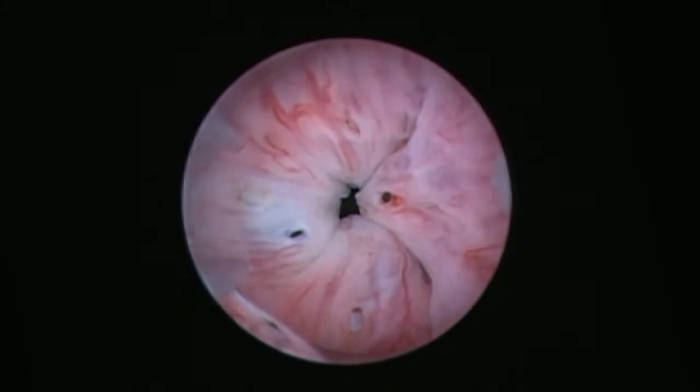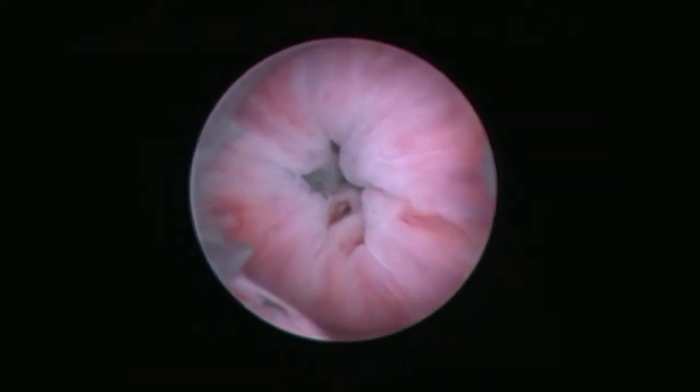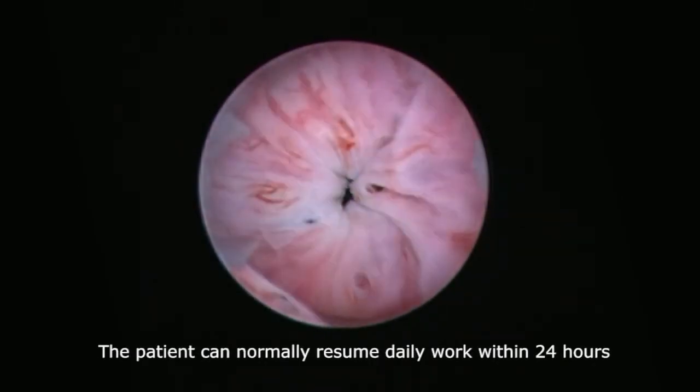After the Bulkamid procedure, the patient's bladder should be emptied with a soft disposable catheter, Charrier 10 to 12. Patients may resume normal work and daily activities within 24 hours of the procedure.